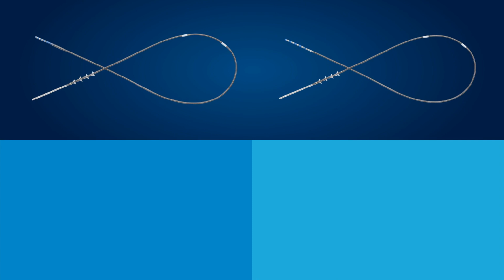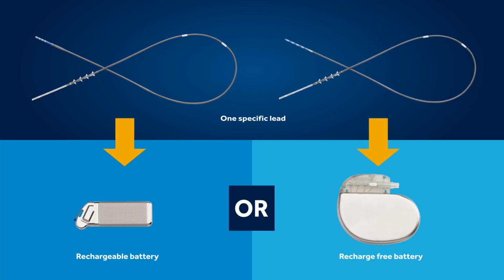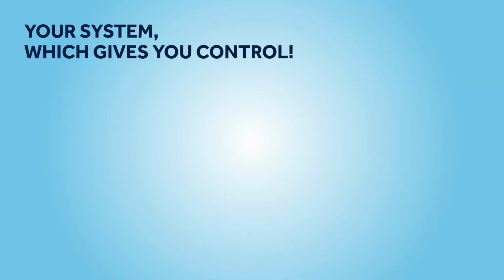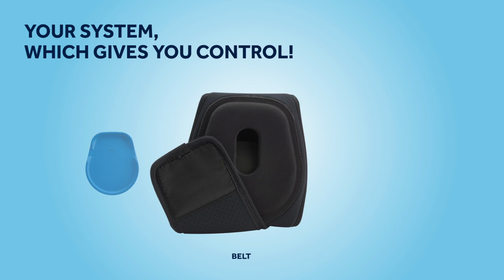Whichever option you choose, the permanent SNM system consists of two components, one lead and one battery. These are implanted under the skin. You will also be provided with a controller, which looks like a smartphone, and a communicator. You will use these together to manage and adjust your therapy. If you receive a rechargeable system, you will also be provided with a battery recharger, its docking station, and a belt for your recharger.